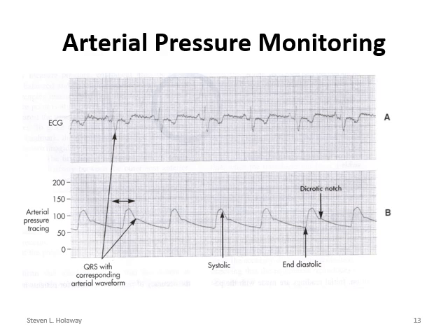Old monitors used to have, and all the new monitors as well, the EKG, and then the waveform for the art line down below it. You can see that here's your QRS, this is your electrical energy, and then on the monitor the mechanical pumping comes just a little bit later. Remember, we talked about how the EKG only represents electrical activity, not mechanical. So you're seeing the electrical and then how it transfers into the mechanical activity of the heart.